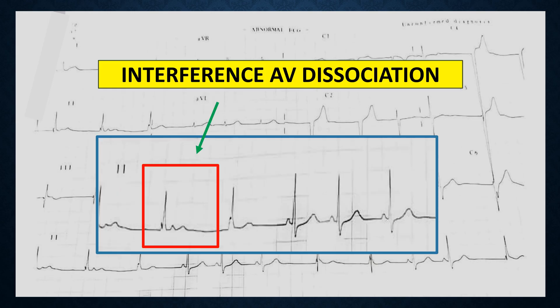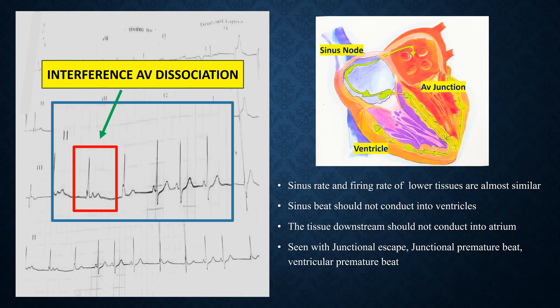Combining all this, what is the result of this presentation? This is called interference AV dissociation. As the name suggests, it is the interference between two things. In this case, there was no correlation between these two complexes and the P wave.